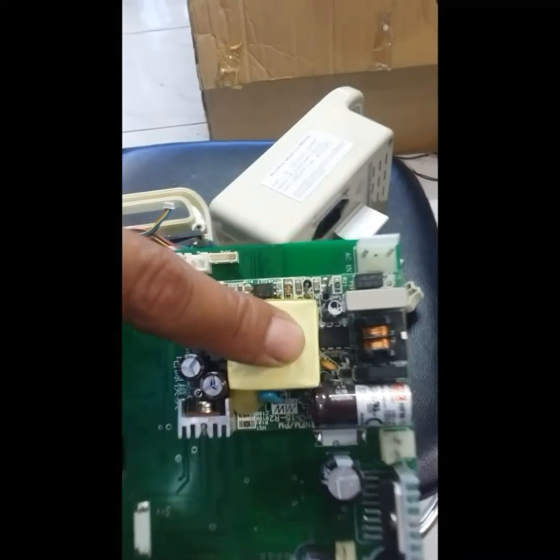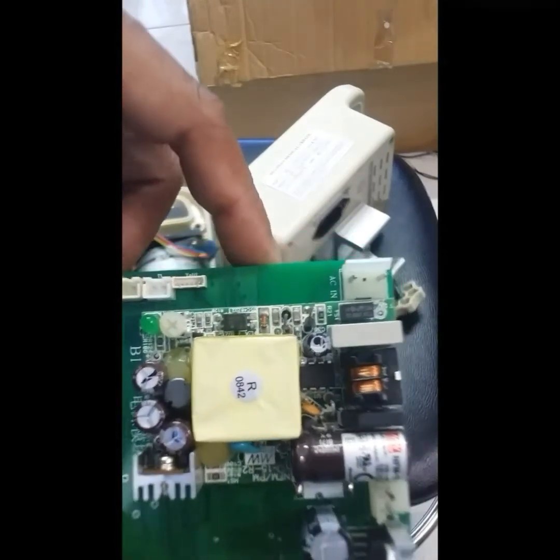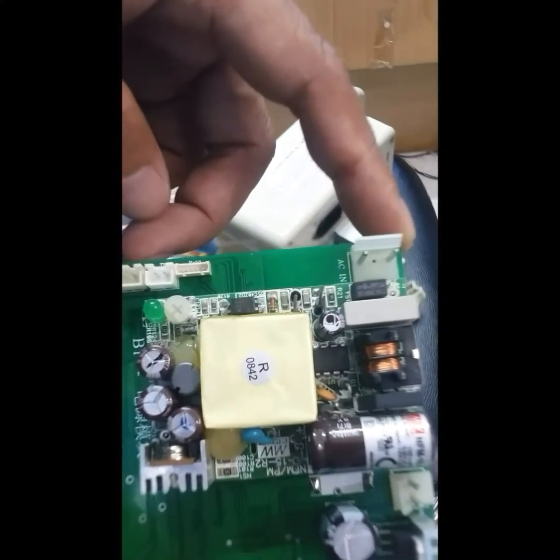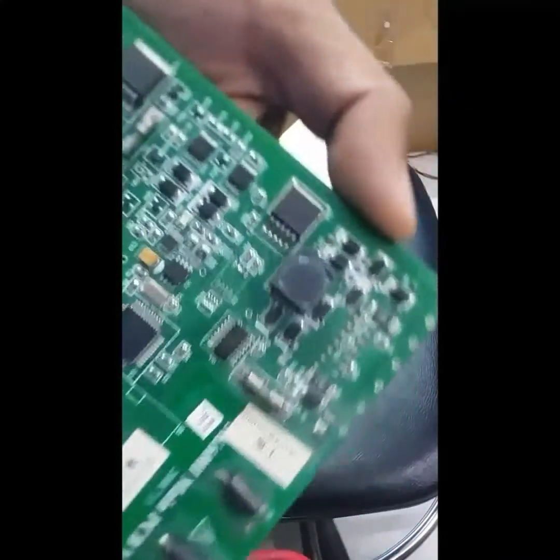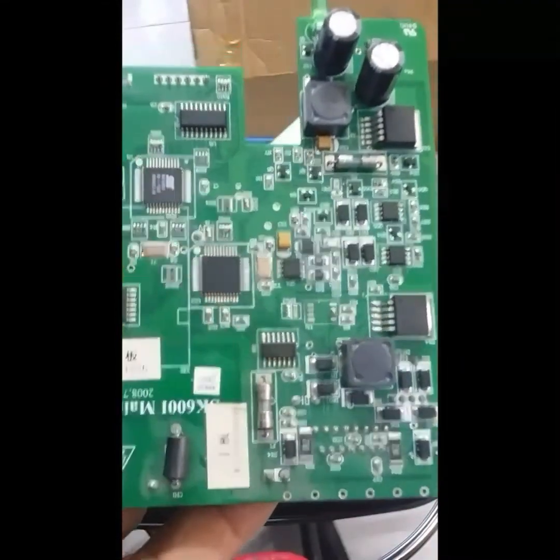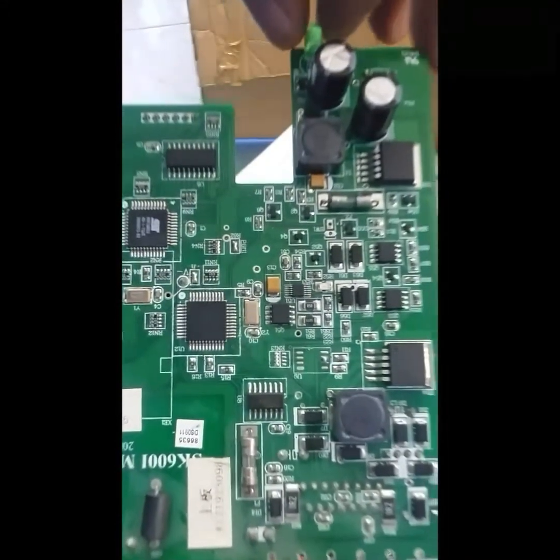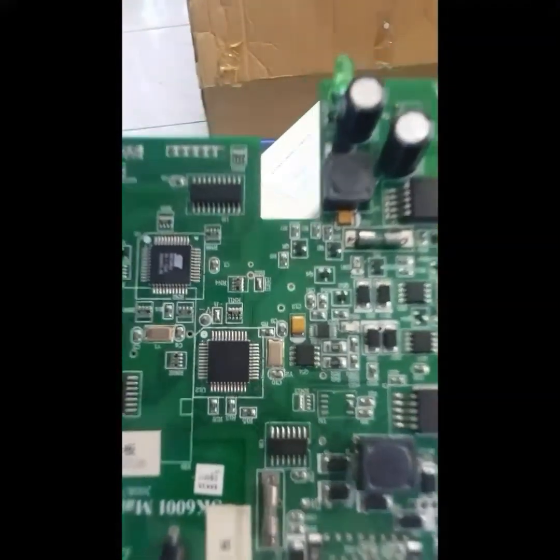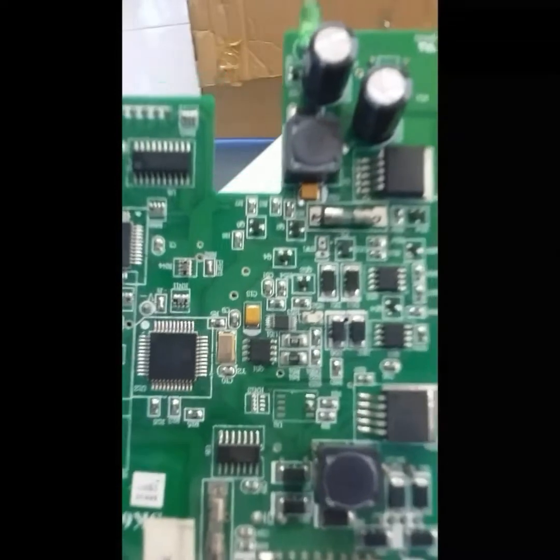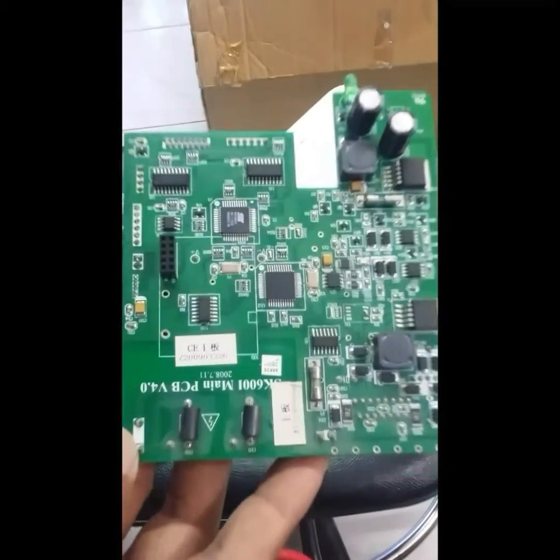Here we have the power supply board. We have the capacitors — the output of this one is 12 volts, 1 ampere. On the other side we have the main board, and on this side we have the fuse and all the circuits. This corresponds to any commands where you set up the infusion pump.